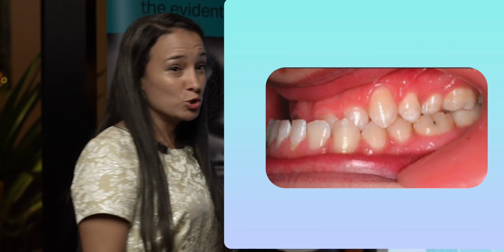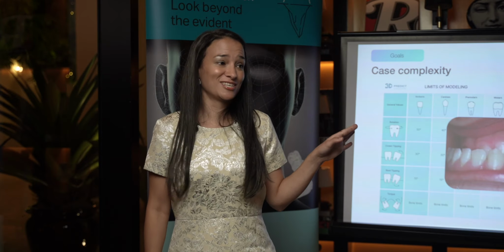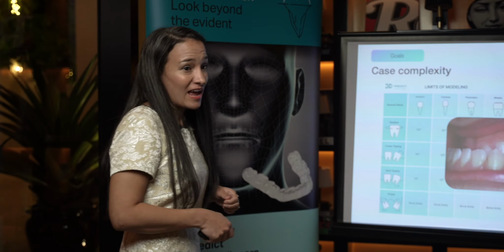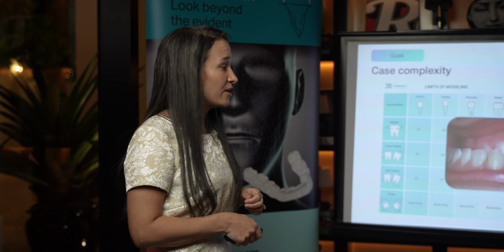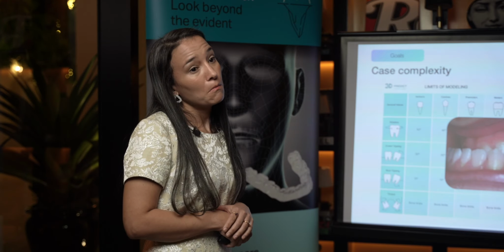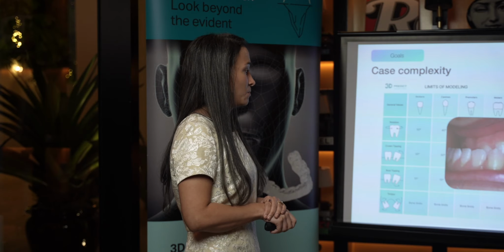Now, would you want to treat this case? I suggest not. Not because 3D Predict can't treat it. We can, within anatomical and predictability limits. If you want to go outside of the predictability limits that this case would definitely need to go outside of, then you're looking at two, maybe more refinements, because this is a very complex case.